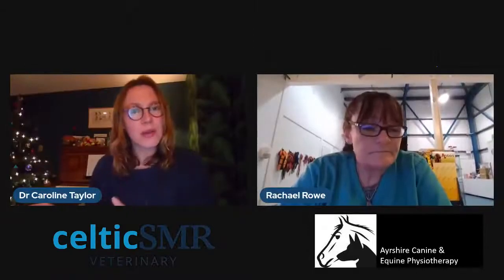You mentioned seeing results immediately. With the practical implications of delivering the laser, you think, well, you'll give 2 treatments twice a week for 3 weeks. That's what a lot of the studies have shown. But I've found myself that it's often immediately after treatment that the dog is so much more comfortable, even during treatment, more so from an MSK perspective.